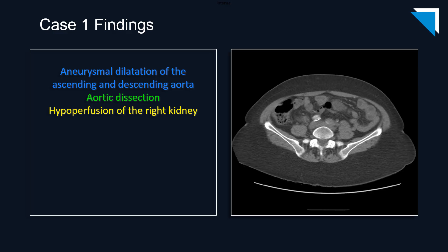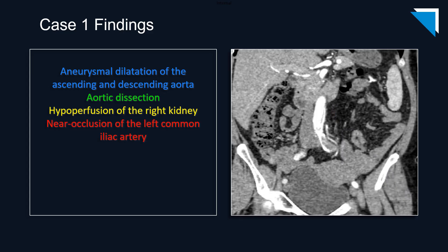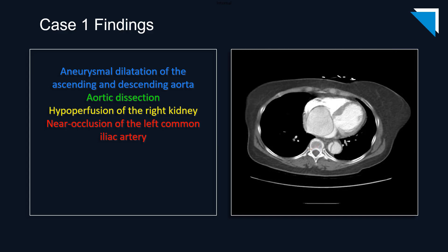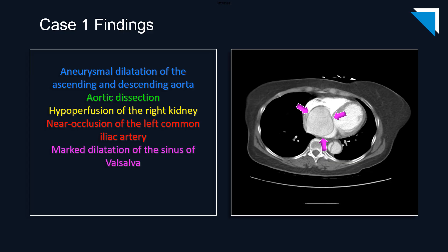But we aren't done yet, even more inferiorly at the level of the common iliac arteries. There is asymmetric hypoattenuation or hypoenhancement of the left common iliac artery, consistent with near occlusion. This coronal arterial phase image nicely demonstrates the trickle of flow in this vessel. But we still aren't done. I hope some of you noticed at approximately the level of the right atrium there is an abnormality. This appearance is due to marked dilatation of the sinus of Valsalva.